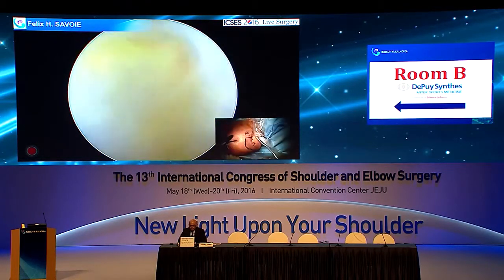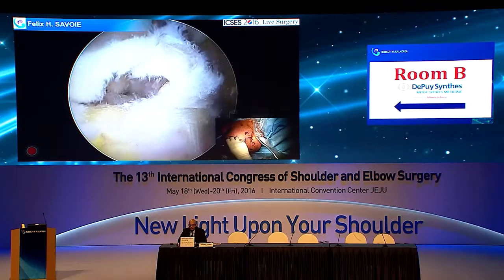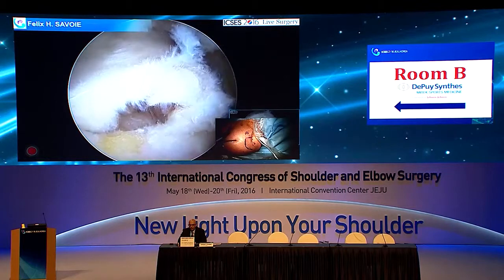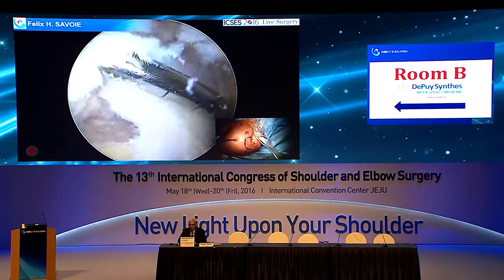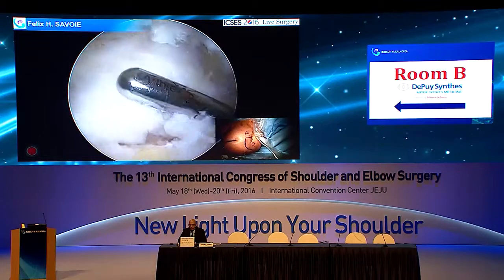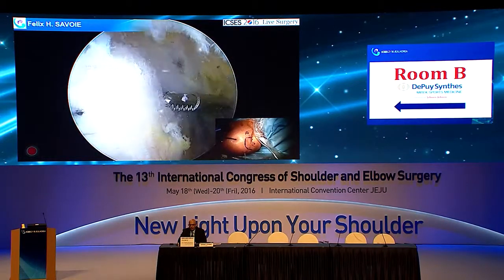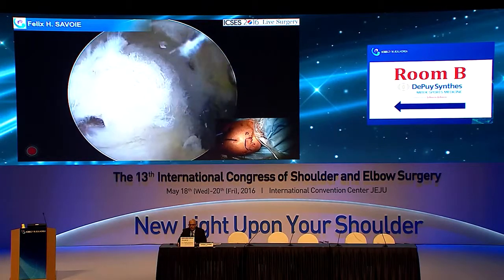There we go. So we'll back up and take another look at the cuff, and you can see how the MRI was very accurate. It goes right into the infraspinatus. We'll bring our shaver in from the back and kind of play with it a little bit and just see if it's really kind of an L-shaped tear or a little oblique to it. And so we really want to bring this part back to here and this part straight over. So a little bit of an L. We can look back here, and you can kind of test, because I like to do retrograde retrieving, what you're going to use to pass your sutures.